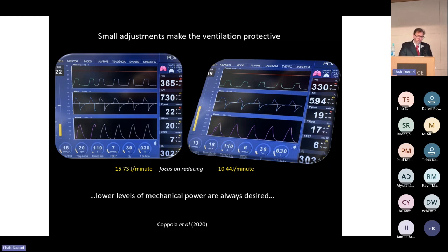Here's the question, can I improve? So the focus on energy reduction can help us with small readjustments of parameters with significant reduction, as long as ventilation and oxygenation are adequately maintained.